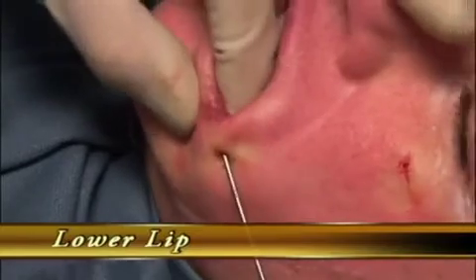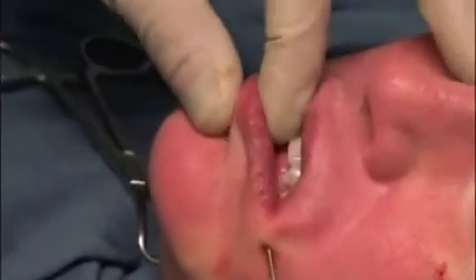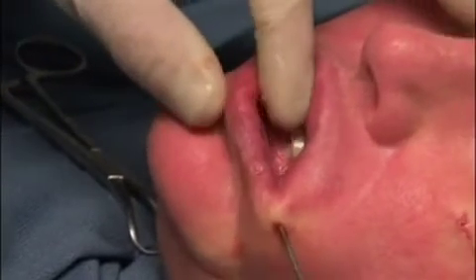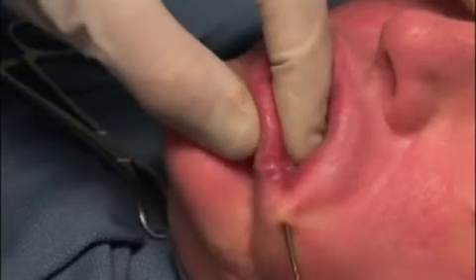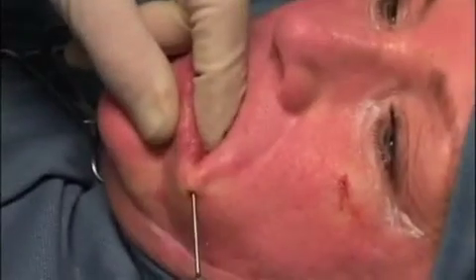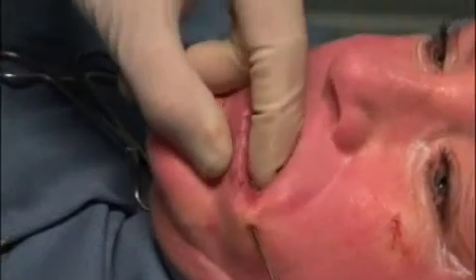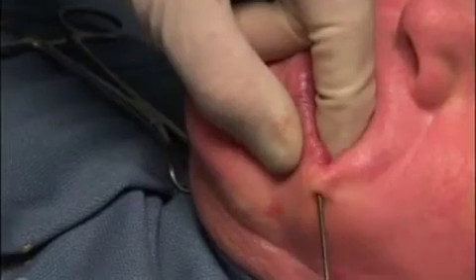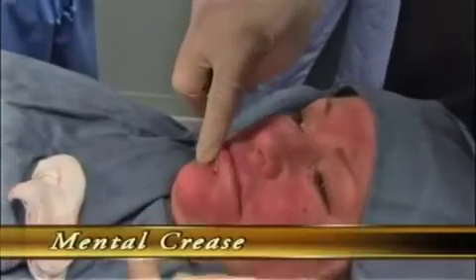Again, one can see I use bimanual palpation of both the inner mucosa and the outer skin to ensure that the microcannula is placed properly in the submucosa of the lip. A fanning technique is used to deposit fat from the inner mucosa towards the central part of the lip and then towards the skin.